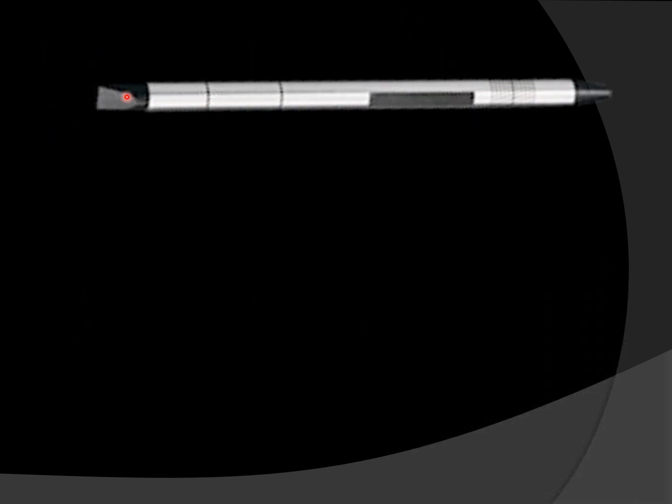Appreciate this is the chisel edge, this is the spherical tip, this is the widened midline groove, and each of the lines that is calibrated in millimeters on either side. This is the flattened side of the incisal guide pin, and also you can see two annular grooves that are present at 37 millimeters and 54 millimeters below the Frankfort horizontal plane. So these spaced out markings act as the anterior reference point in the absence of a facebow transfer.